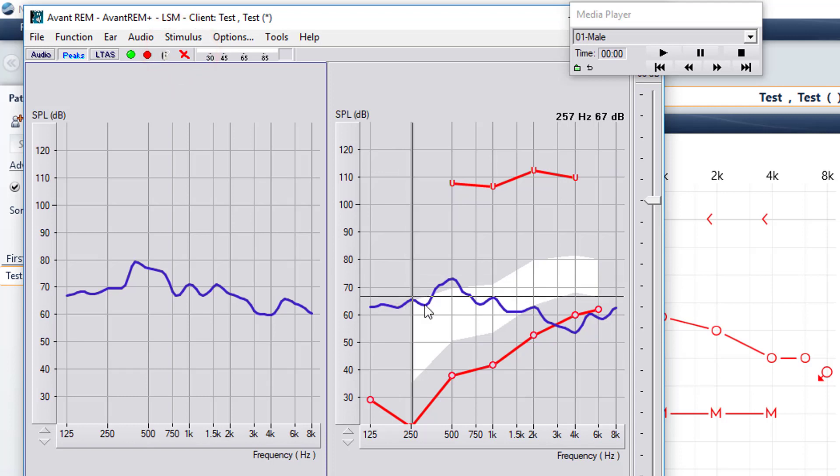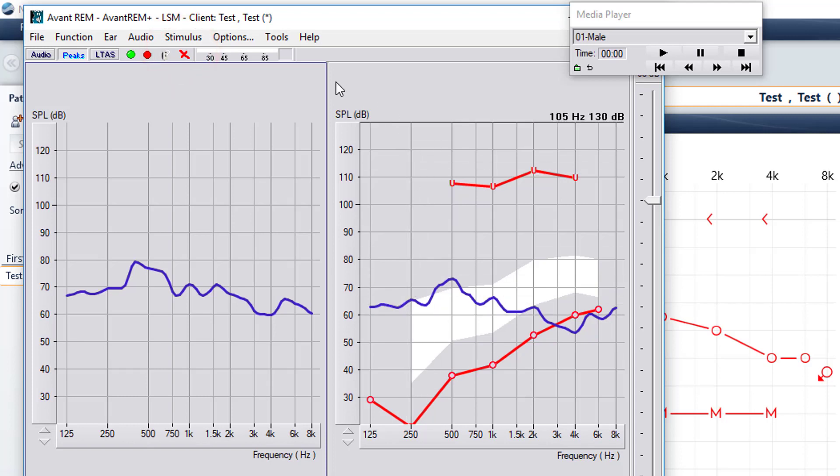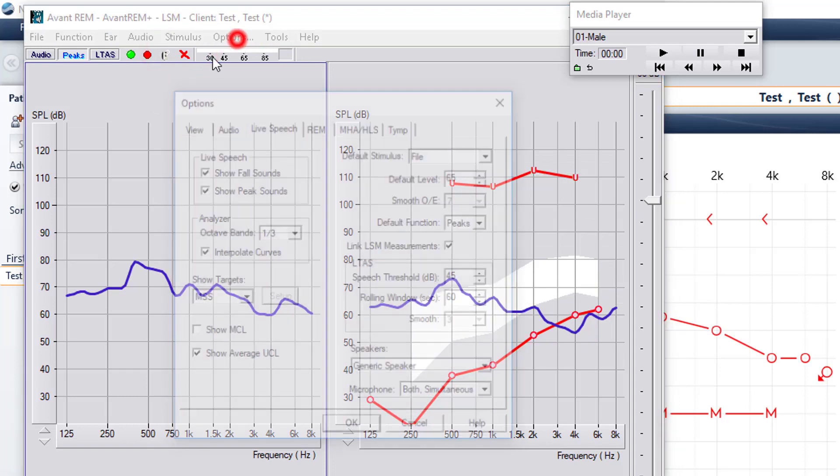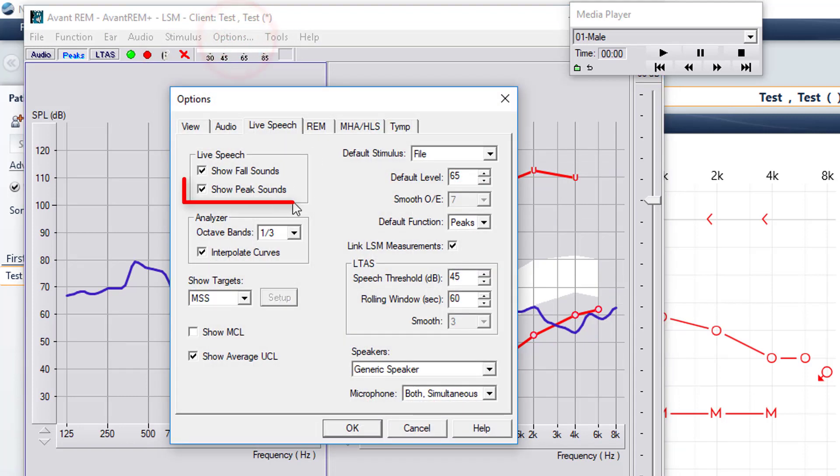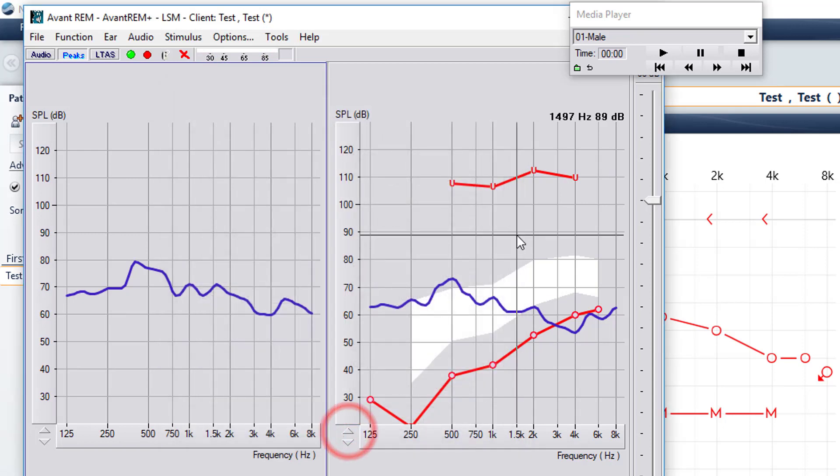At the beginning of the session, one of the things under the options that I did select was show peak sounds. And this is very beneficial to any providers that are using the on top mode or have dual screen.